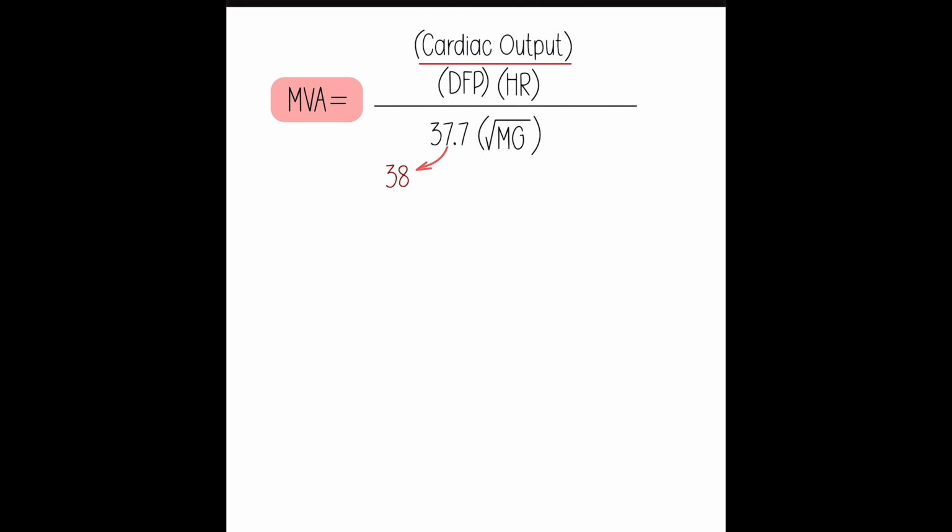All right, this should look oddly similar to the aortic valve area Gorlin formula. There's not a Hakki, there's not an estimate here. And you have, again, cardiac output in milliliters per minute.